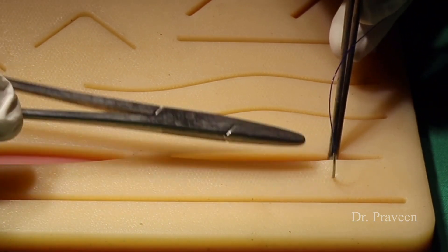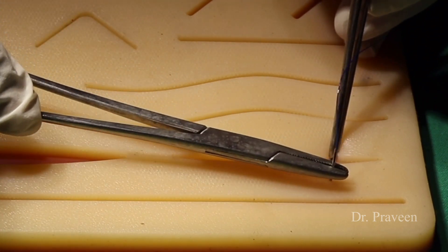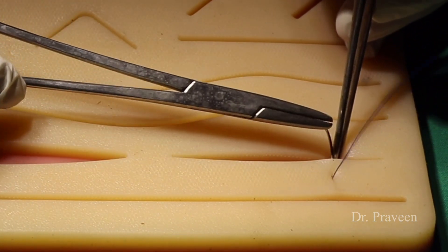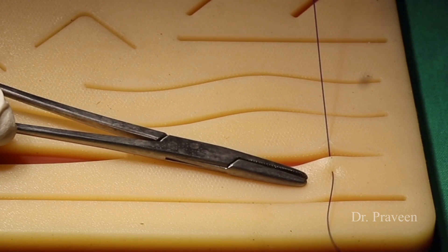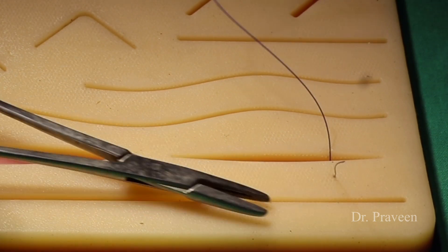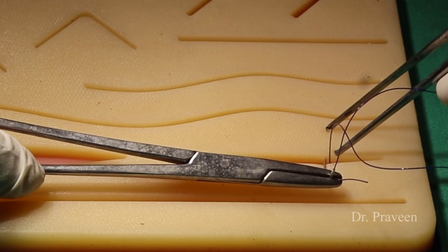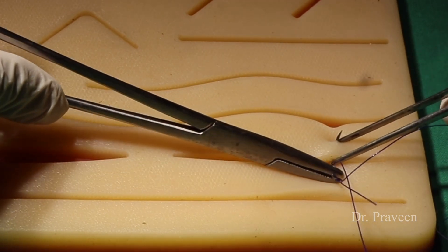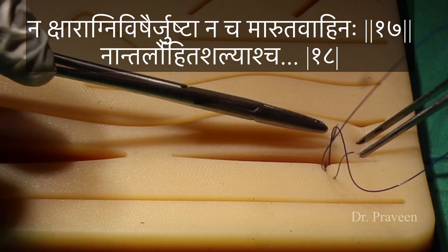Right now I am demonstrating the suturing method called Rijuganti. The word Rijuganti means that in the way of Sivana karma, a knot — Granti — comes in between. So the simple interrupted suture can be compared with the Rijuganti. Meanwhile, let us look into the contraindications for Sivana karma.